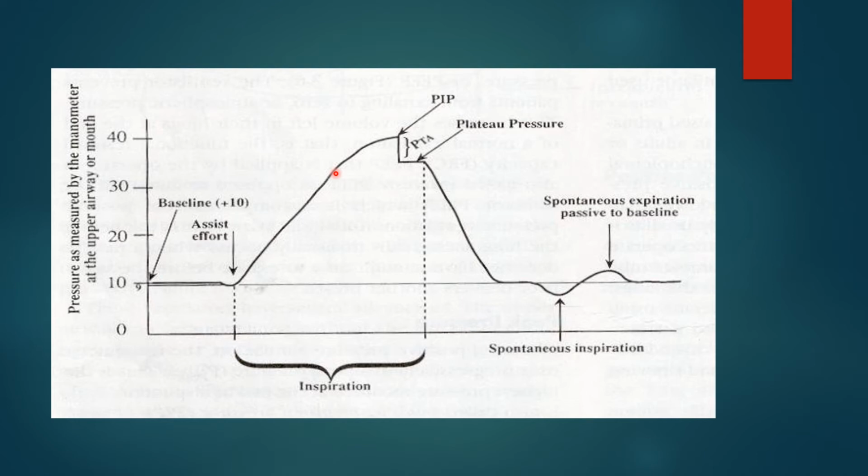That's a patient triggered breath. And the trigger was probably pressure triggering. And then we did the inspiratory hold for looks like about 1 second, and then let the patient exhale back down to his 10 PEEP.